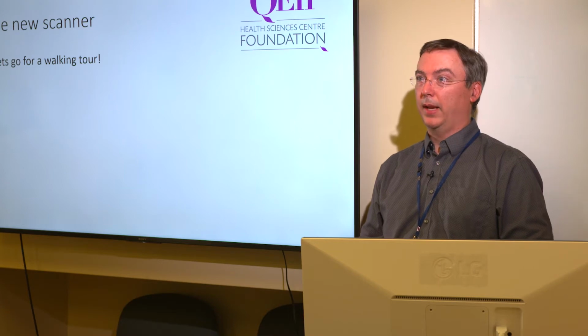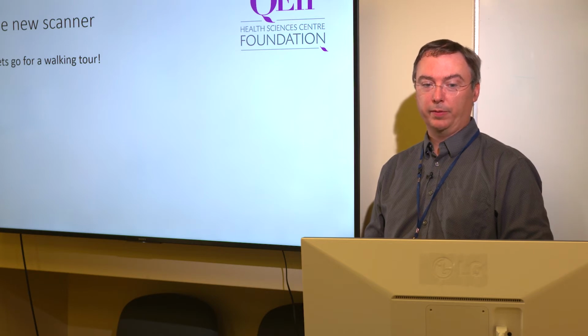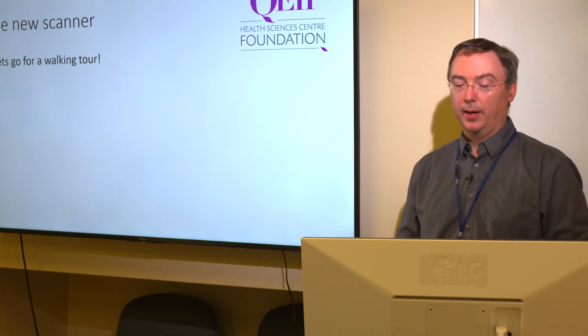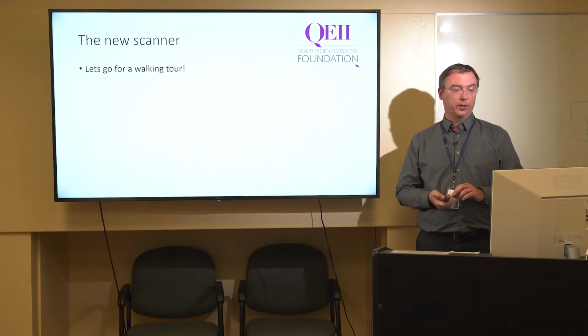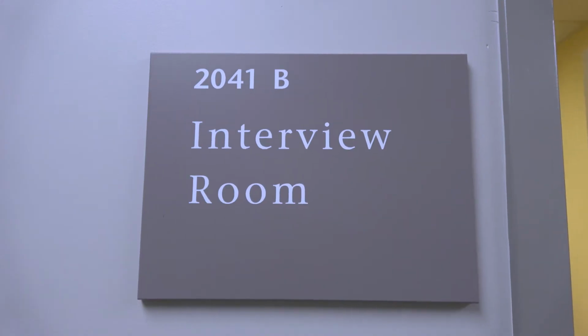So now I wanted to show you the new scanner, what we actually managed to purchase with the cooperation of the provincial government and the generous donations from folks like yourselves contributing to the QEII Foundation. So we'll head out. So a patient would arrive at the hospital, they'd get themselves checked in, and they'd come to the waiting area of the PET suite. So we've got a number of chairs. We're a little bit down on capacity because of some restrictions that are in place because of COVID. So the patient would come and they'd wait here until the technologists are ready for them. They might bring a family member with them for support, and then they'd come on into the PET suite.